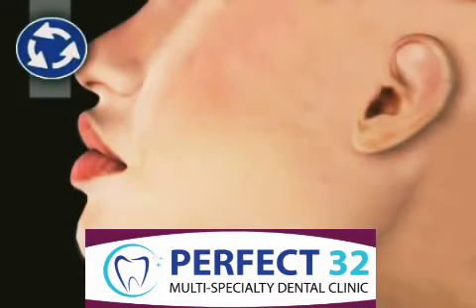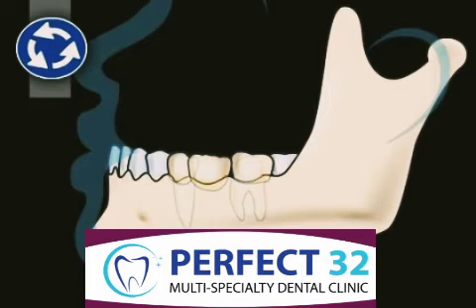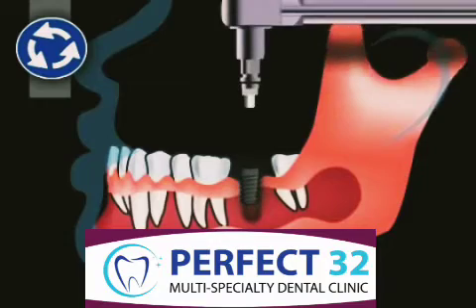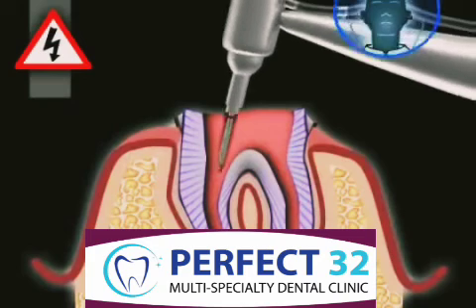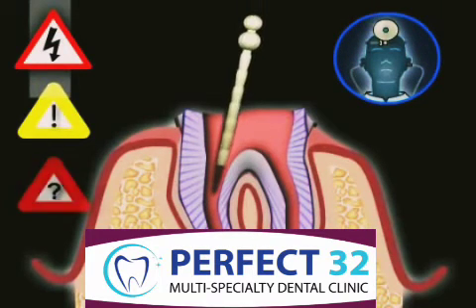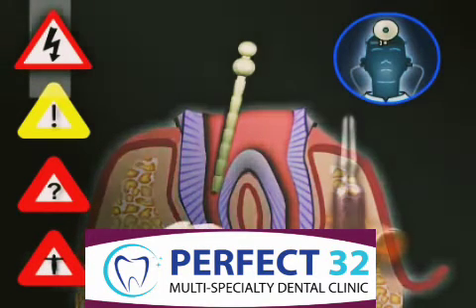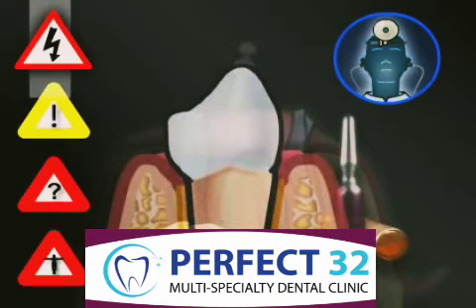There are no alternatives to the core buildup, except for pulling the root of the tooth and producing a different artificial tooth, such as, for example, a prosthesis or an implant. You can find out more in the video entitled Implant. The potential risks involved with core buildup are negligible when performed by an experienced dentist. Nevertheless, complications may occur in individual cases, possibly requiring additional measures. Every additional measure may in turn lead to further complications that may eventually result in tooth loss.